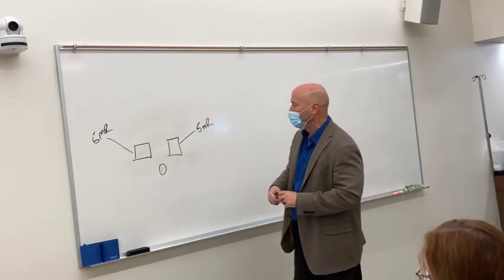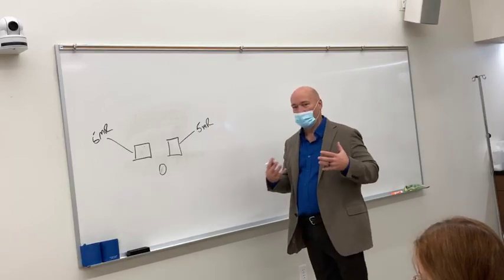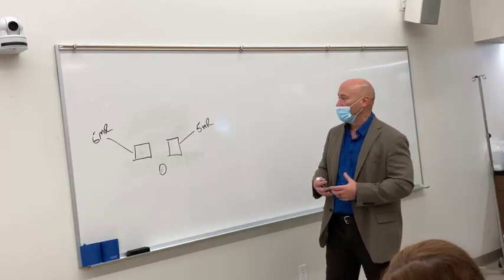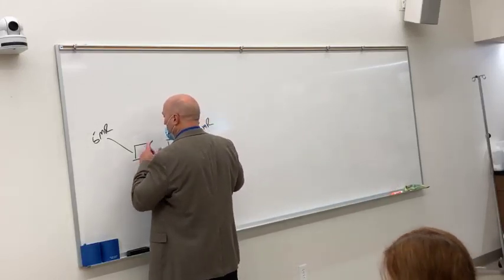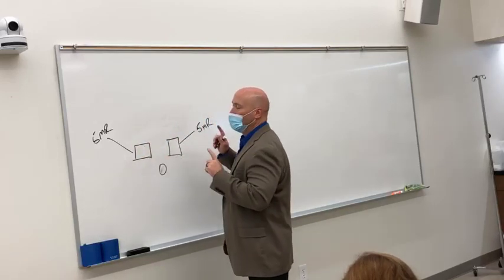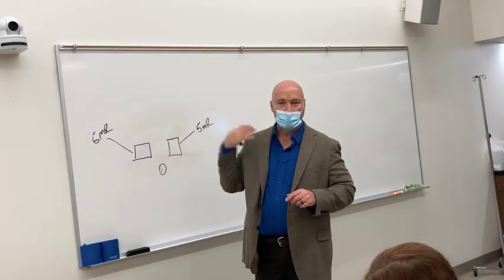So they average out, but they're individual exposures. Let's say the patient's got a clear chest, they don't have any kind of condition, and we make an exposure and position the patient properly. Then what's going to happen is when these things receive 5 mR, they're going to send a signal over to the timer circuit to kill the exposure.